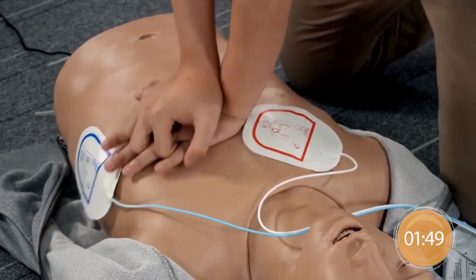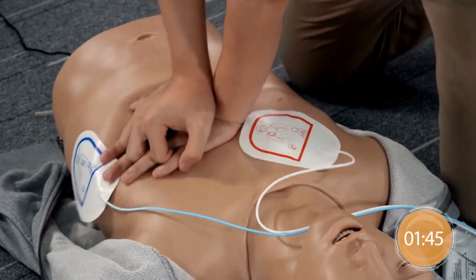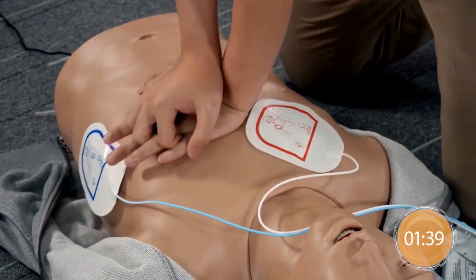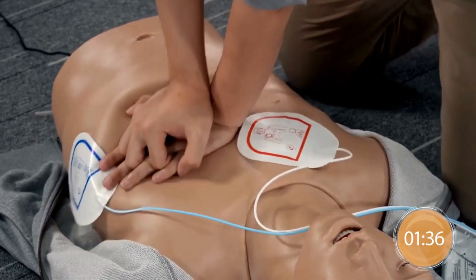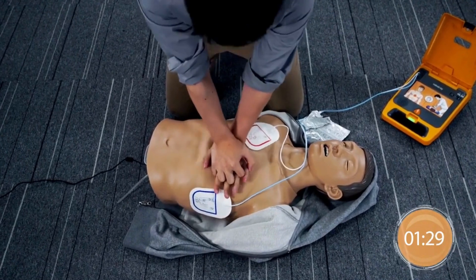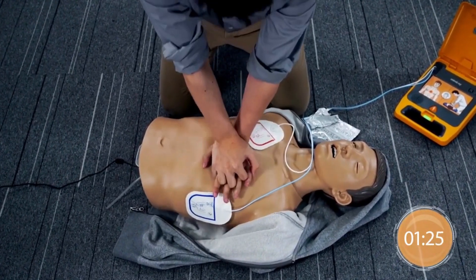Give chest compressions immediately. Continue to compress without rescue breaths. Place one hand on the center of the chest, the other hand on top of the first hand. Interlock the fingers. Continue to push down hard.